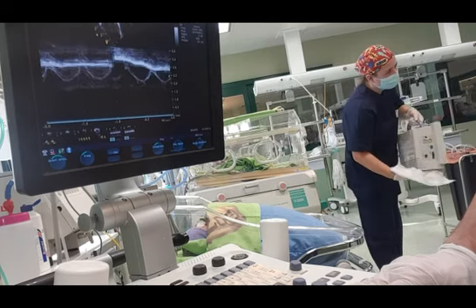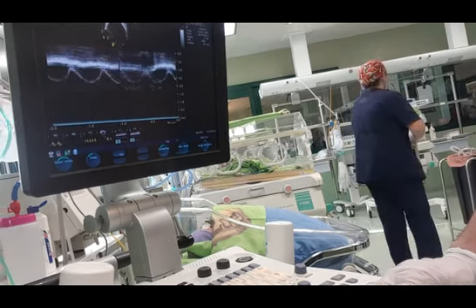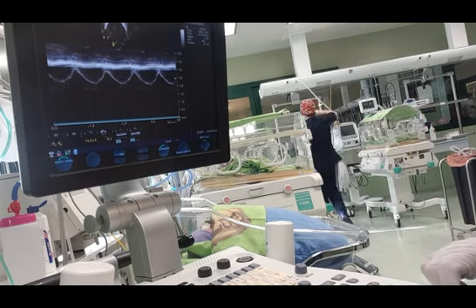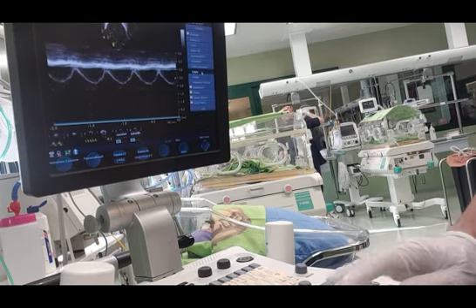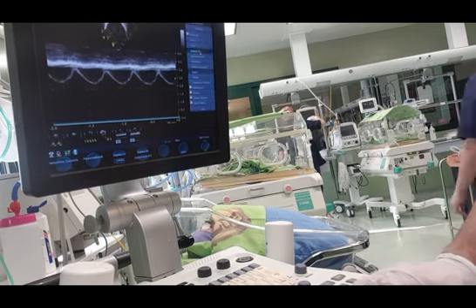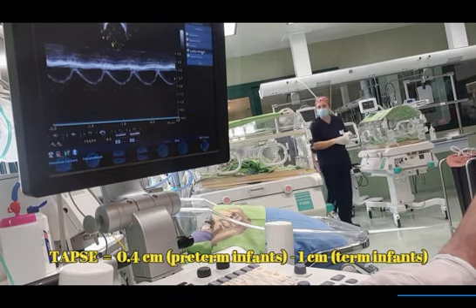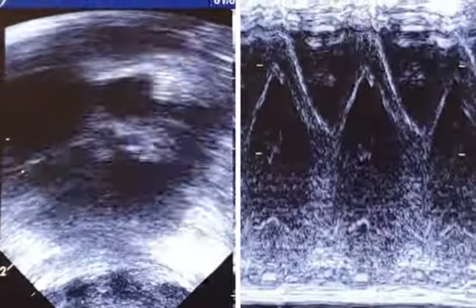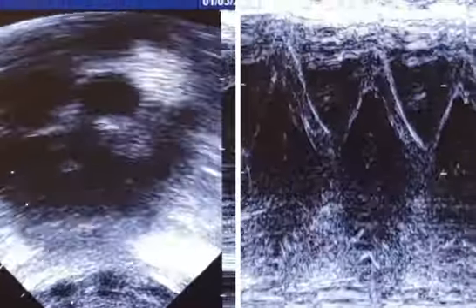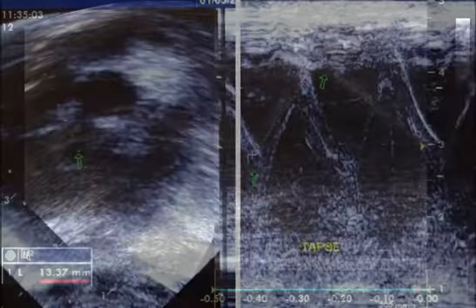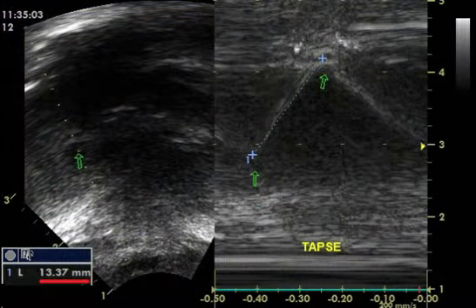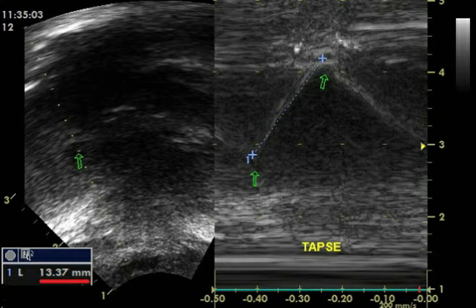However, it should be noted that tricuspid annular plane systolic excursion is both angle and load dependent. Normal values in the neonatal population range from 0.4 cm in preterm neonates at lower gestational ages, up to 1 cm in term neonates. Diminished values below 0.4 cm are predictive for the need of ECMO and death in infants with persistent pulmonary hypertension.